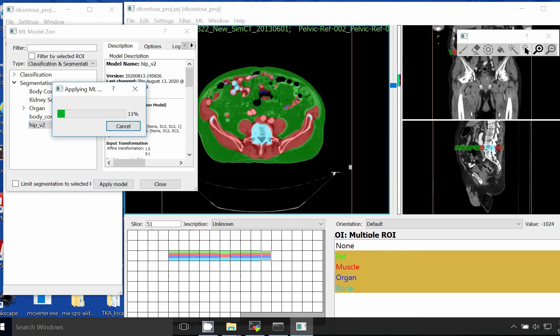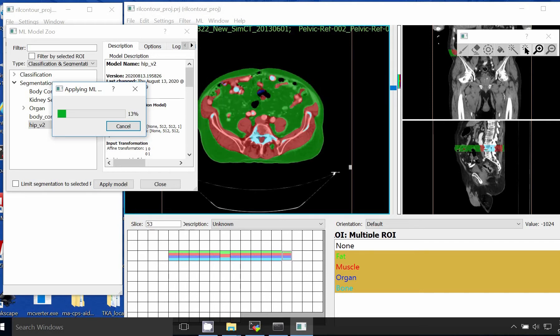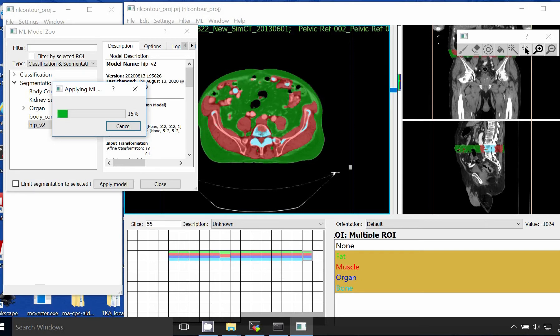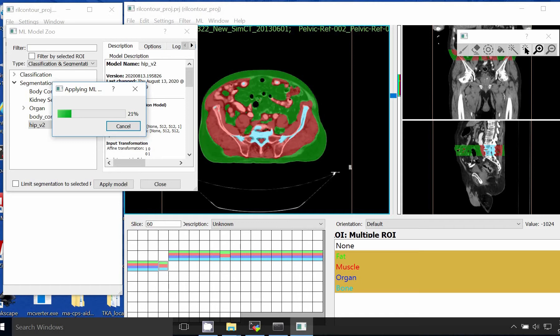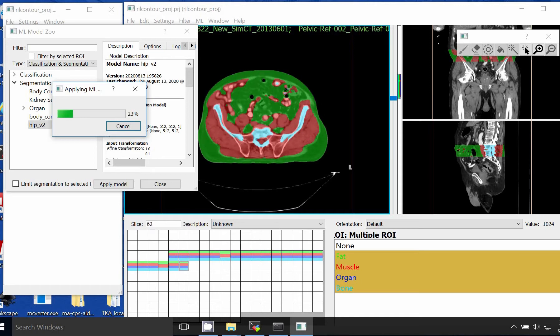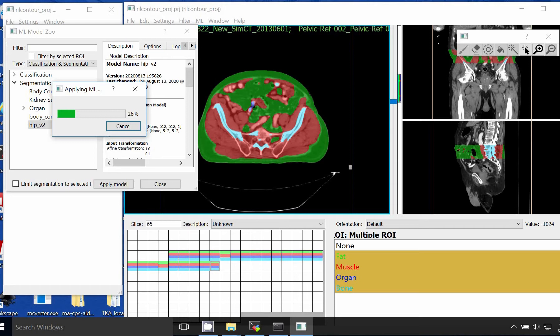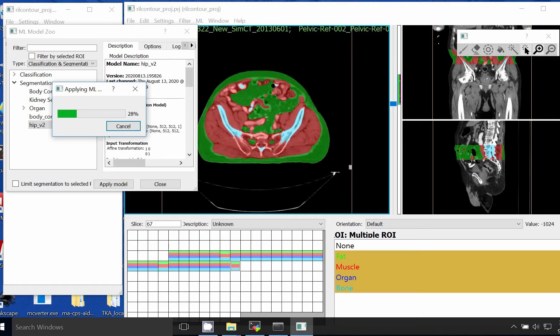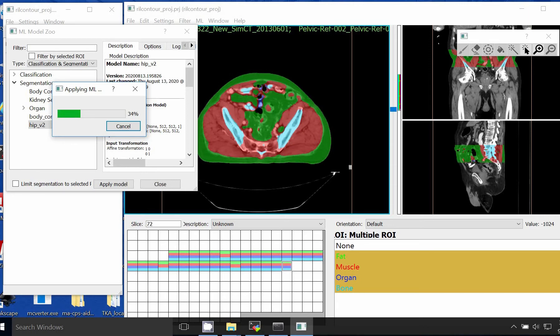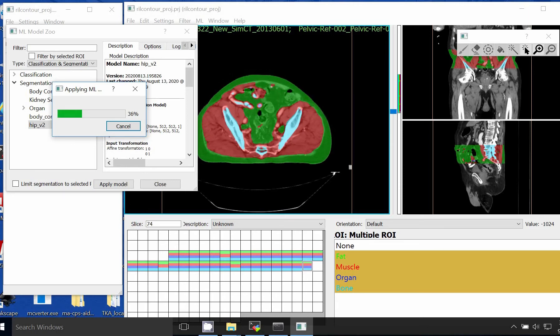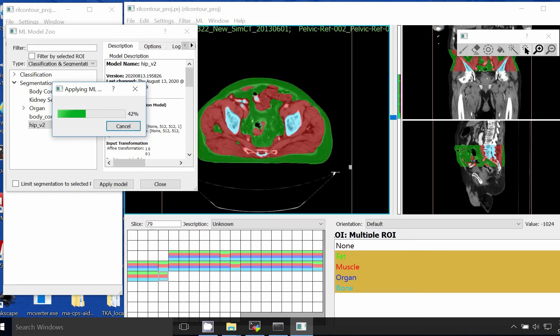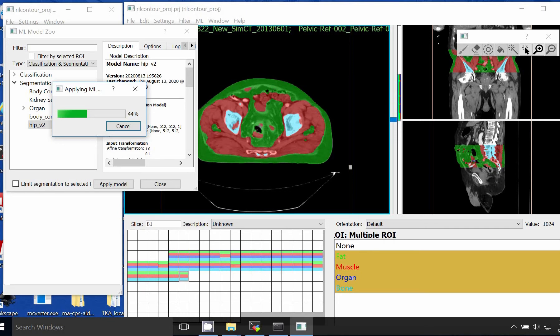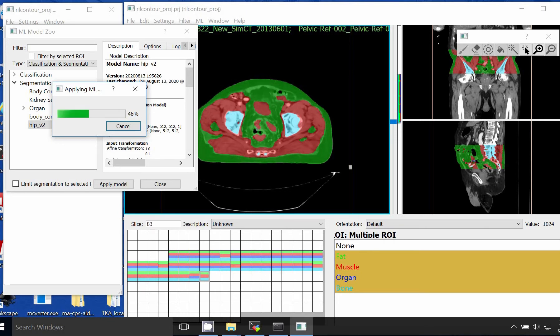This is a variant on a UNET model — it's a 2D model. I pre-trained this on abdomen CTs at about the liver level and then fine-tuned it on 25 of these hip scans. The purpose of these segmentations is to correct the machine learning output and then go back and retrain the model on the corrected scans. I should also note this is running on just my standard HP laptop — you don't necessarily need GPU acceleration when doing inference.